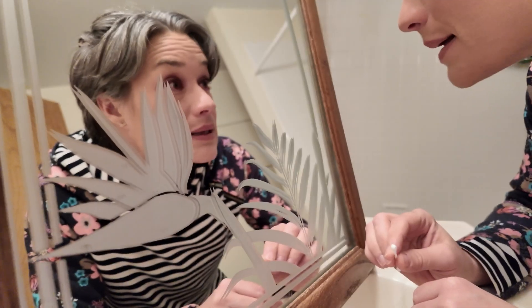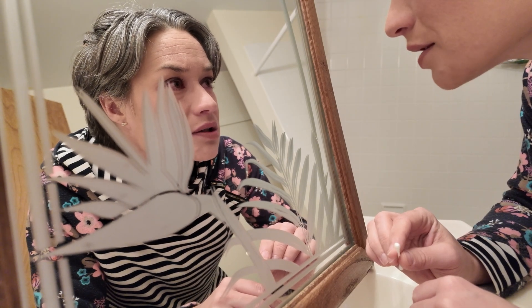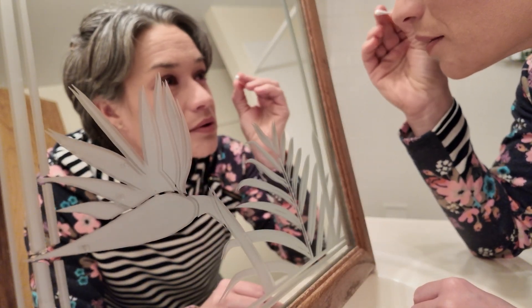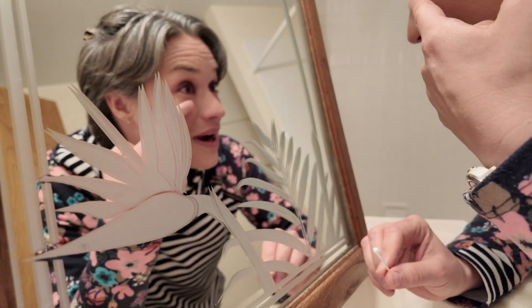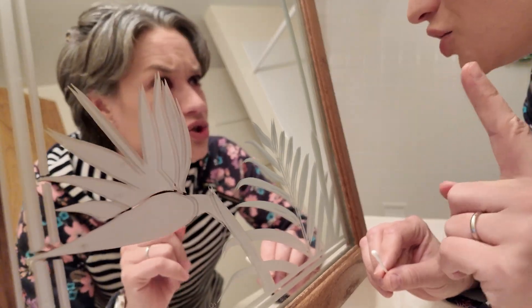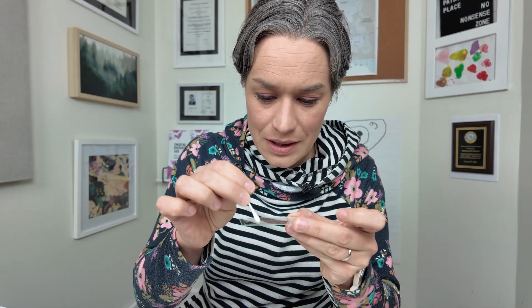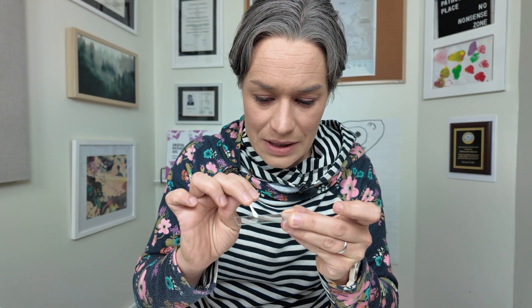Yes, I wear full makeup — is this the smartest thing with bilateral conjunctivitis? Probably not. And sticking a q-tip into your eye isn't the smartest thing either, but I already tried on the other eye yesterday and I was fine. Don't try this at home. For the second sample I'm going to do a different technique and tap it so as not to make it too thick.